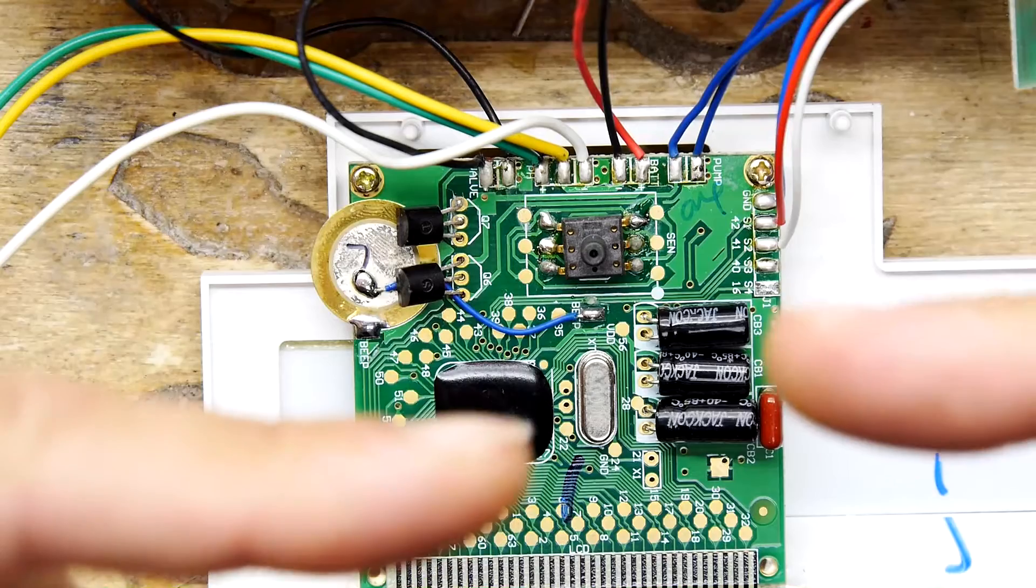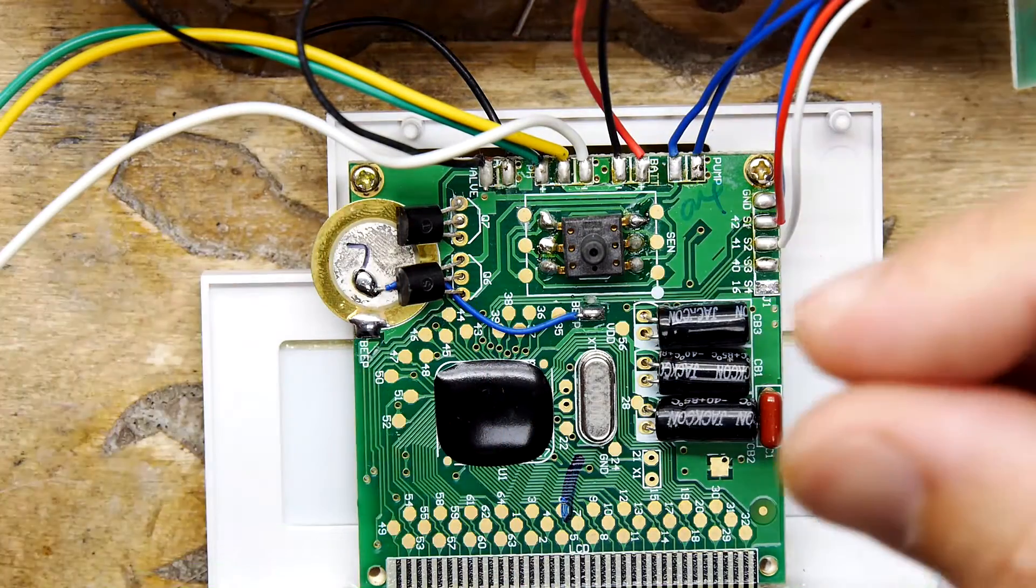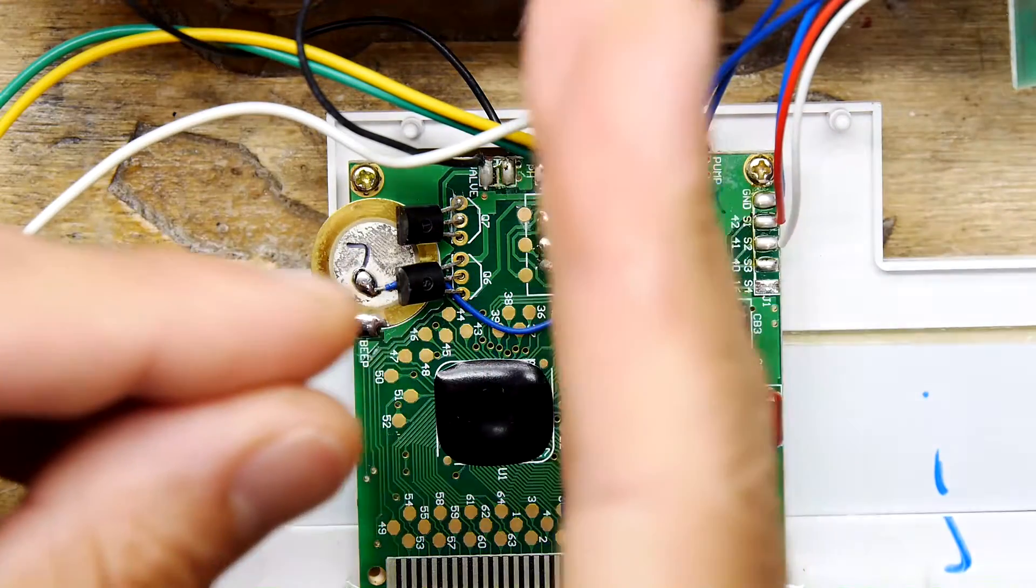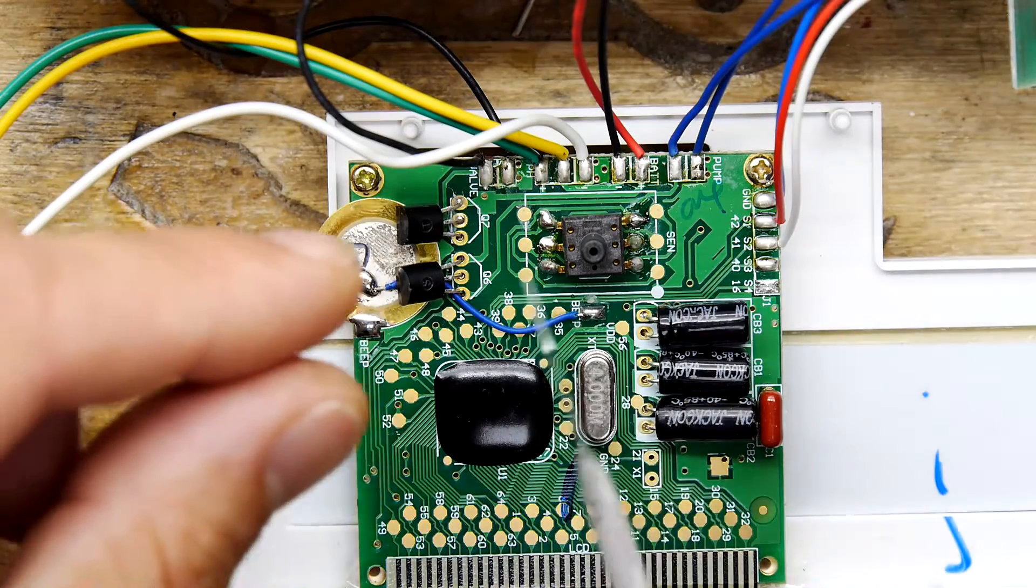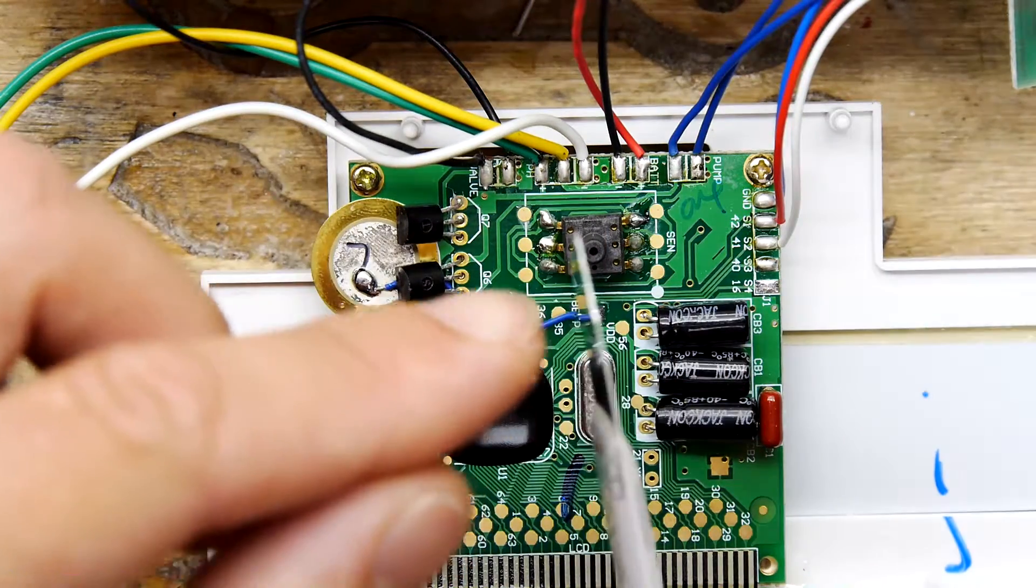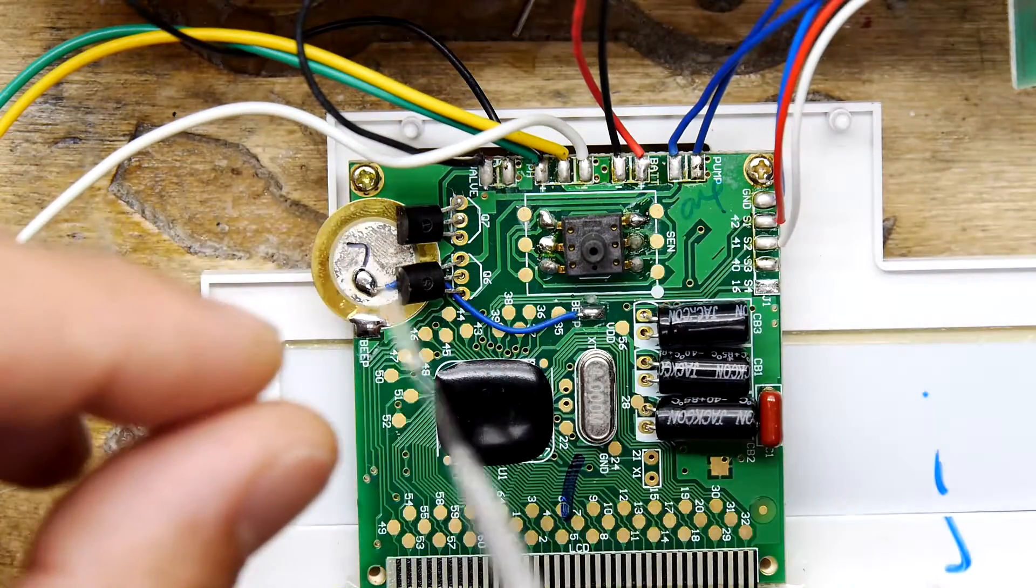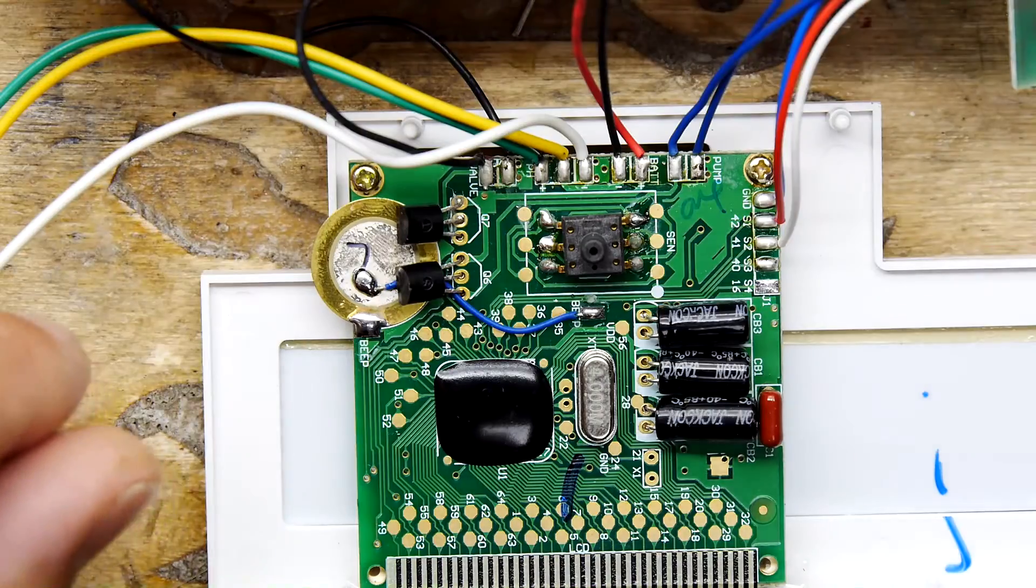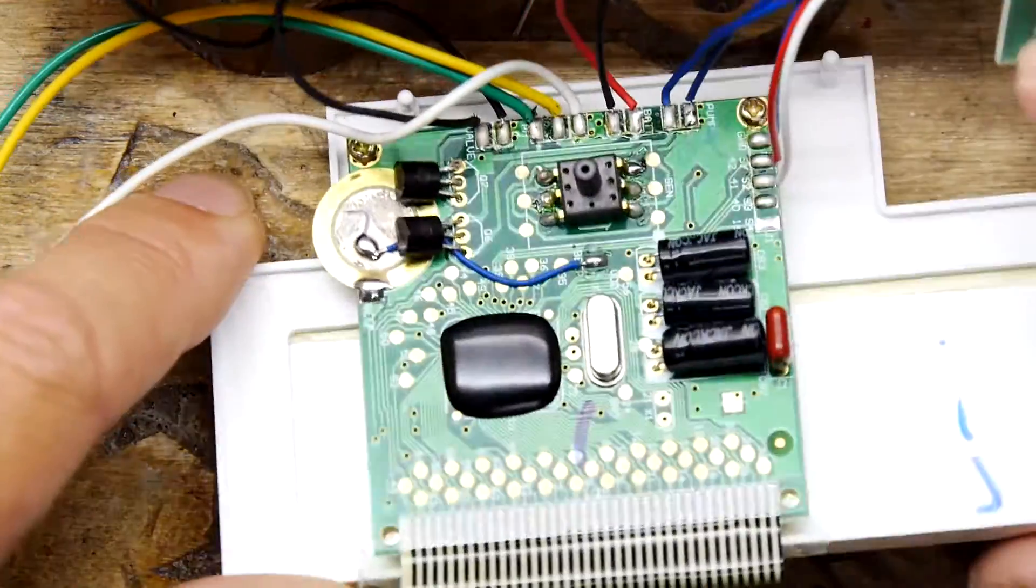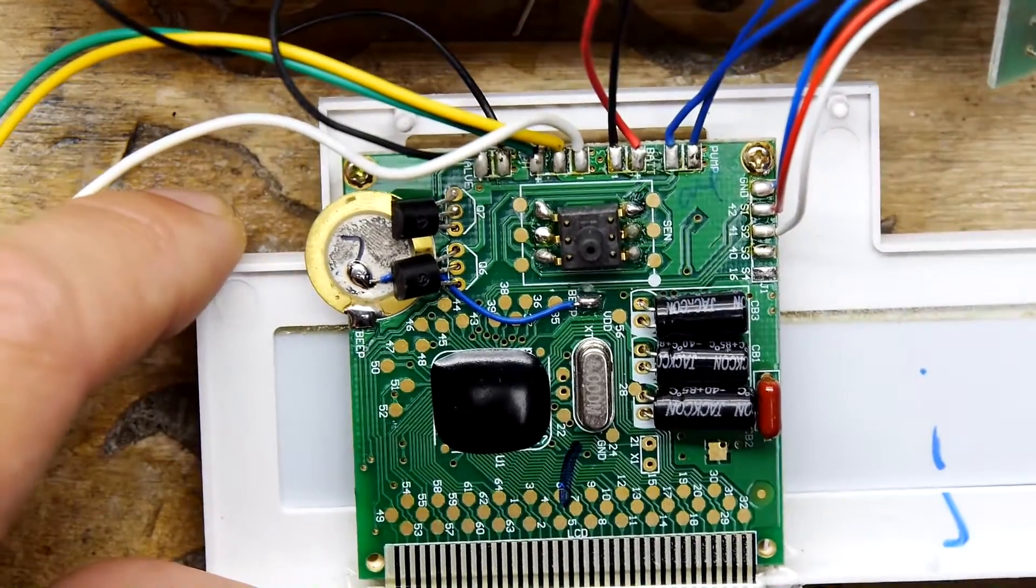Sometimes they've got two ports. So they're a differential between two sides of things. Sometimes they've got one port and then they're just sort of closed on, say, one side. And it's comparing the pressure to atmospheric. So there's all sorts of configurations. They used to be quite expensive. I don't know if they still are. They probably are.